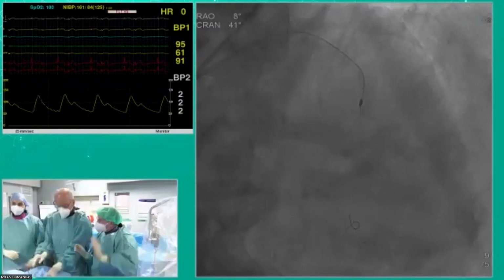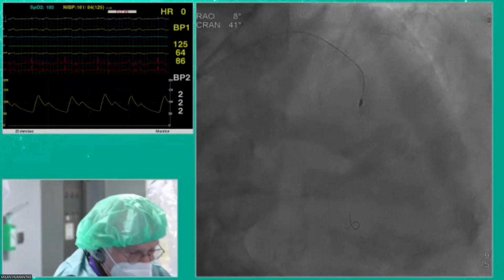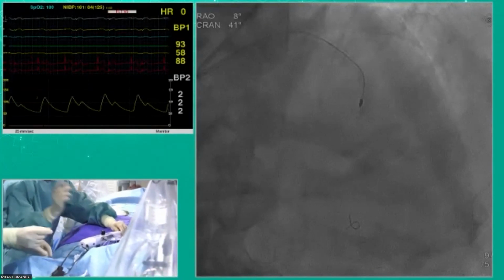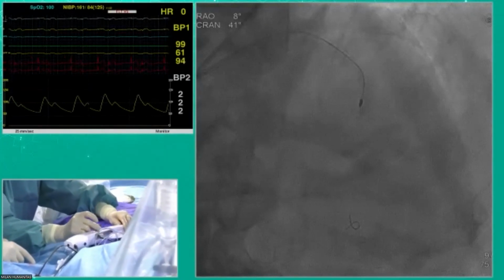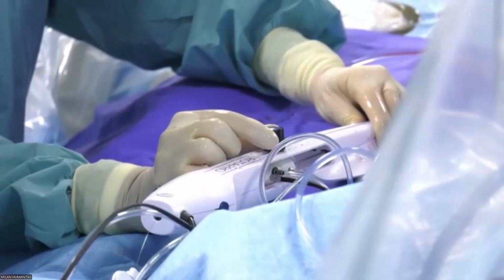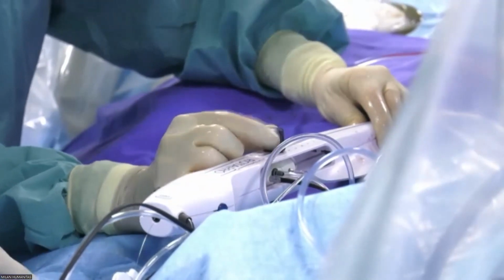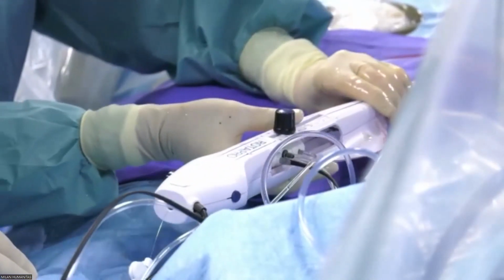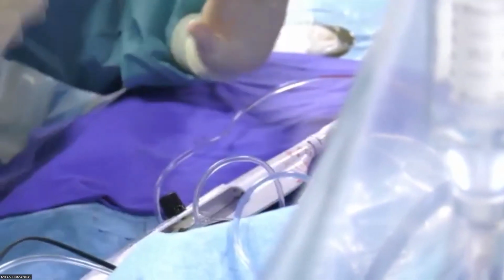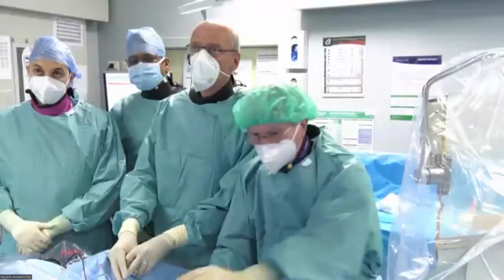I like the way to gain speed. It's the only way to gain length. So I repeat it. The assistant holds these and looks at the ceiling. Doesn't do anything, just holds these. Looks at the ceiling, or the nurse. And the other person advances the machine with speed. But it's important that he holds and looks at the ceiling, not look here.